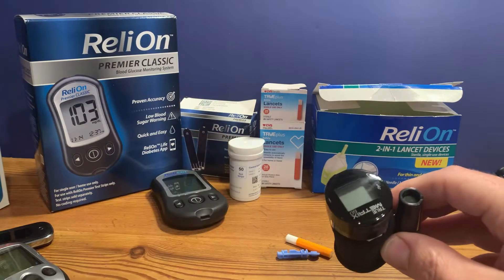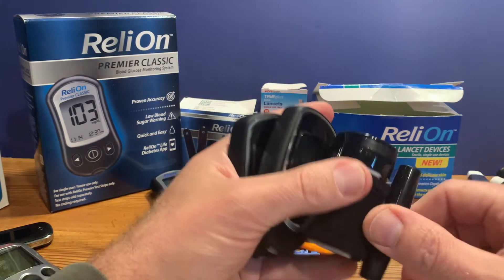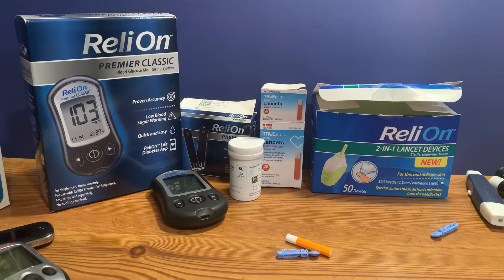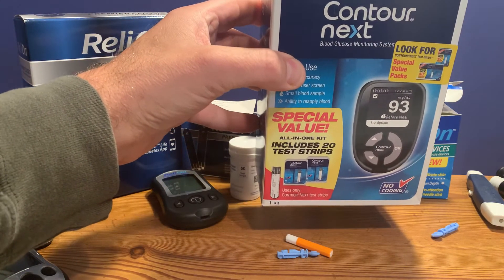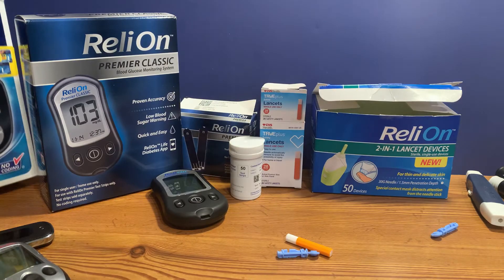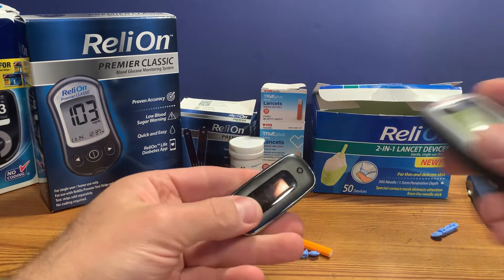Those all use the True Metrix test strips. There are obviously many different brand-name products available — Contour Next is just one of the many; One Touch and AccuChek are also very popular.